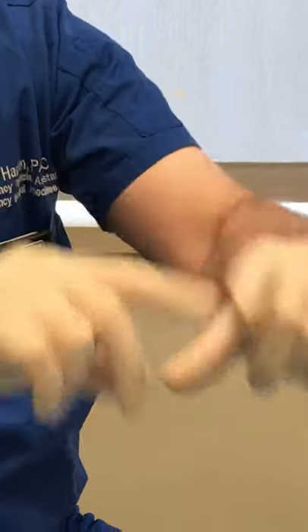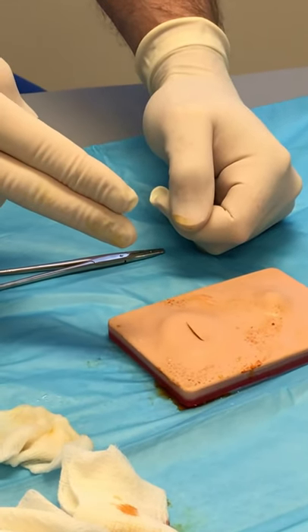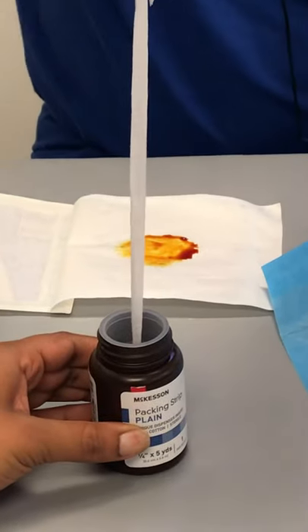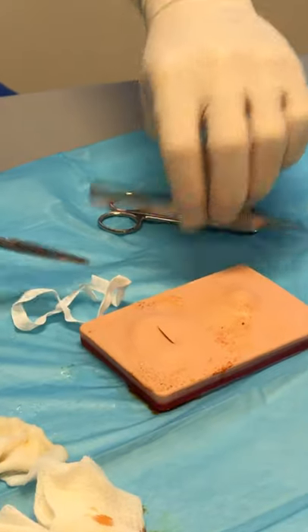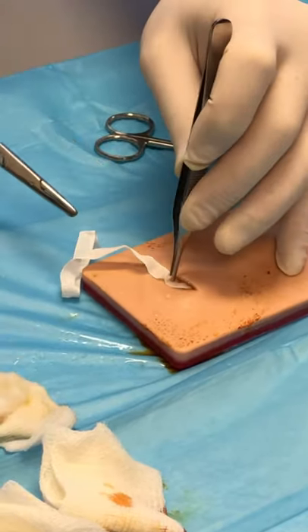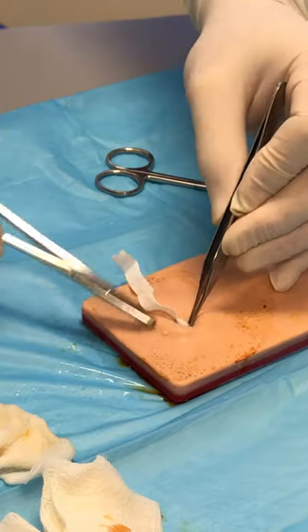Another option is to make a cross incision — make a plus sign — then get scissors and cut one corner off so that corner will always stay open. If it's somewhere visible like an arm or leg and you're worried about cosmetics, then you'd go with packing. The sterile packing strip comes in a bottle — just hold it sterile and don't contaminate the end. The only function of packing is to wick out anything else, help keep the incision open, keep working out anything that gets stuck in there, and prevent it from healing closed, because the abscess will want to reform.